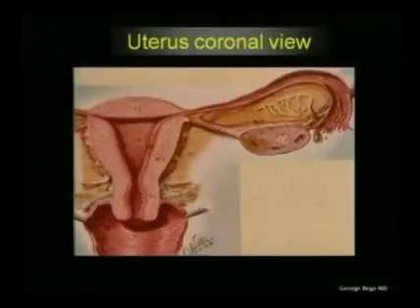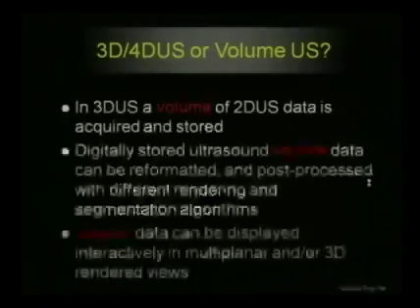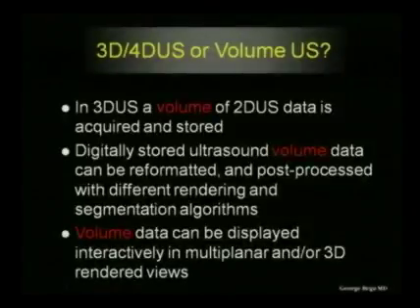This is another diagram showing nicely the coronal plane of a uterus. So this is really the impossible plane. Okay. A huge confusion over the years has been over a simple fact. The fact is that 3D, 4D ultrasound per se are marketing terms. And when people are using these technologies, beginners, there is a confusion there as to what they represent. Basically, what they represent is volume acquisition.